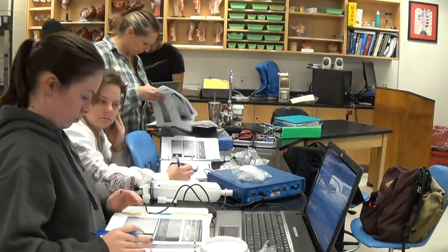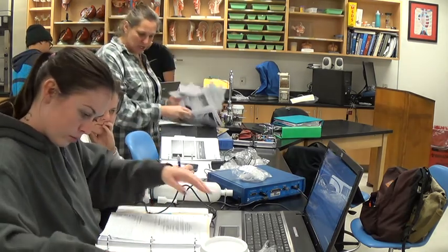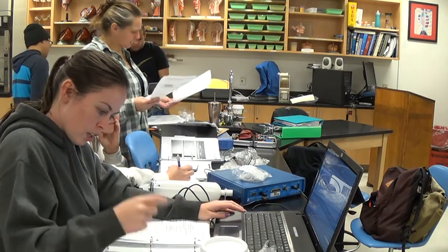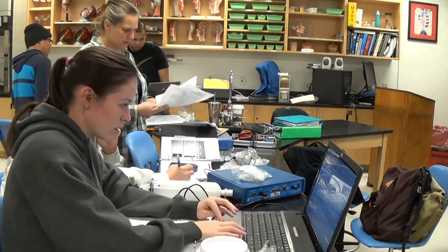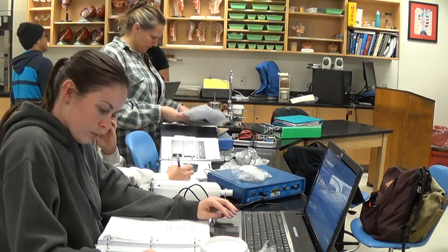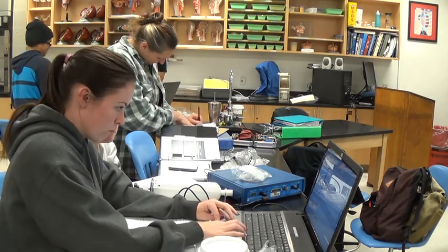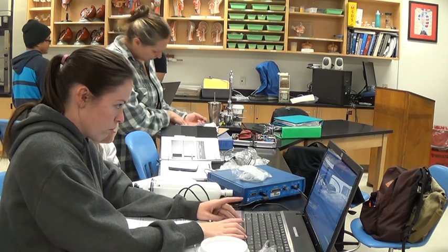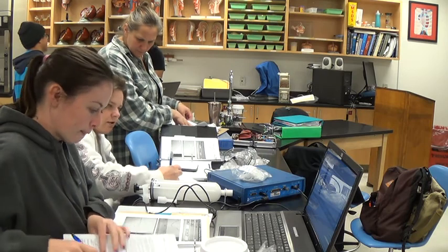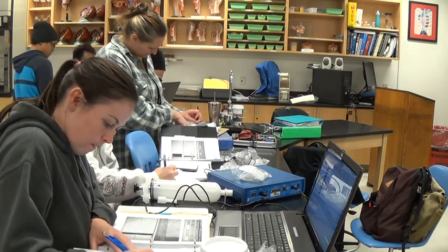I know, but when I was doing it, I feel like mine was a lot. I wish we could see yours. Let me just go to that and see what that is. The maximum inhalation. Okay, it still doesn't matter. It doesn't change. Okay, what did you want me to do? Inspiratory reserve on the dashboard.